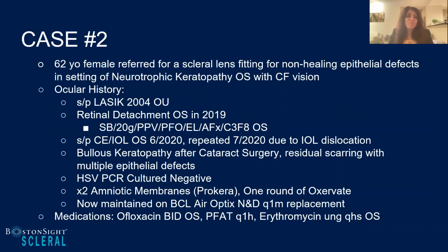There's this beautiful 62-year-old female. She has gone through so much in her life. Her left eye, she had LASIK in both eyes. She had a retinal detachment. Then she had cataract surgery. The lens got dislocated. She had to go back in and have that surgery repeated.